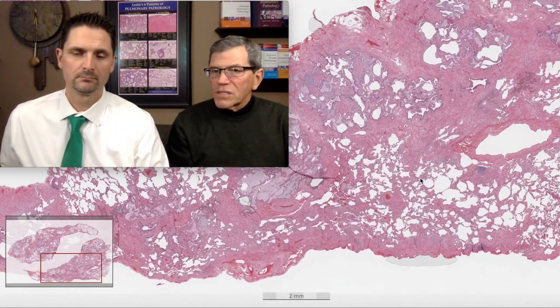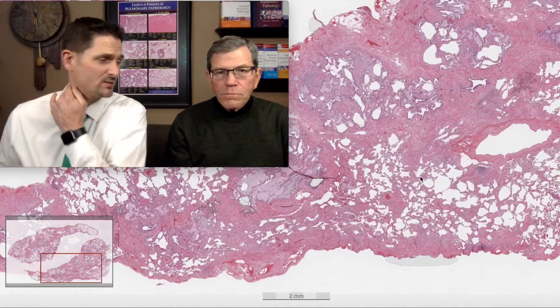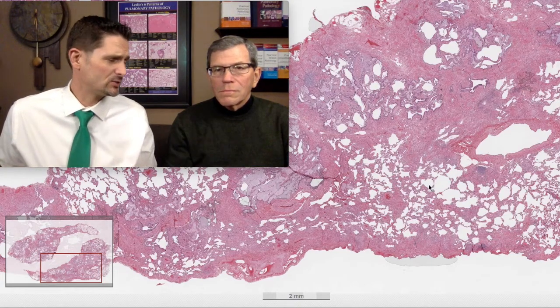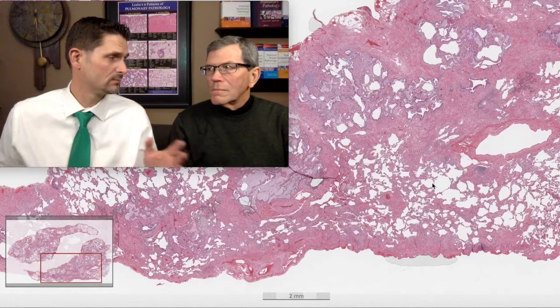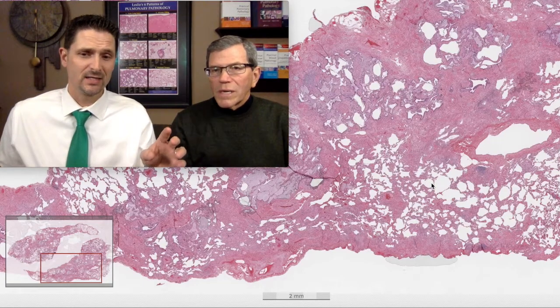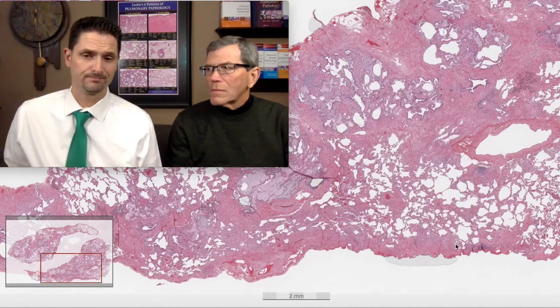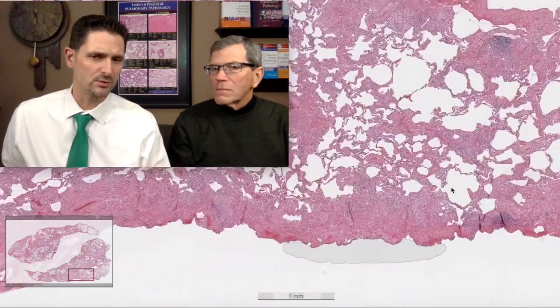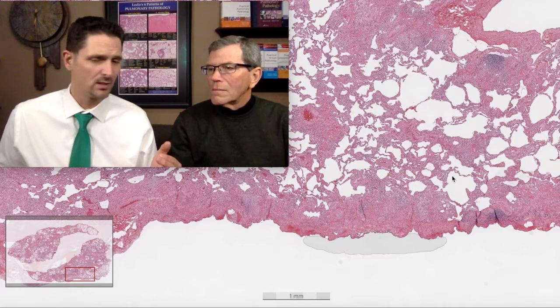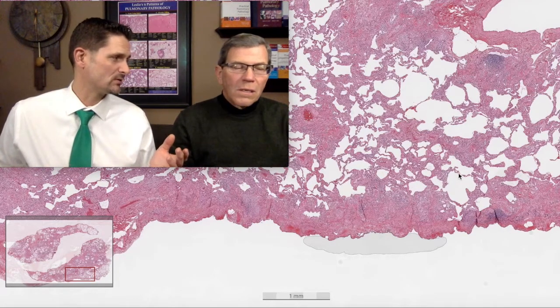The biopsy was sent with a call of usual interstitial pneumonia — UIP. It's not surprising someone would call this UIP, because the classic teaching in pathology is: if you have a patchy fibrosing process with areas of active fibroplasia — so-called fibroblast foci — and geographic and temporal heterogeneity, then you are supposed to call it usual interstitial pneumonia. UIP is the pattern encountered in idiopathic pulmonary fibrosis and elsewhere.